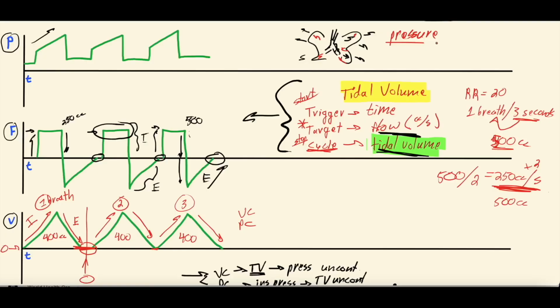And peak and plateau pressures and things is going to be a different video. But when you set a set flow rate, that's going to slowly, as it flows air down and pushes those lungs out, build up an increasing pressure as more air is delivered into the lungs until you get to that point where the breath is done. You can see these line up, right? Breath is done, at which point the patient expires, and the pressure drops back down to this set pressure, which, if you watched our original video, is the PEEP, the positive end expiratory pressure, which we won't go into here. Definitely check out that other video.